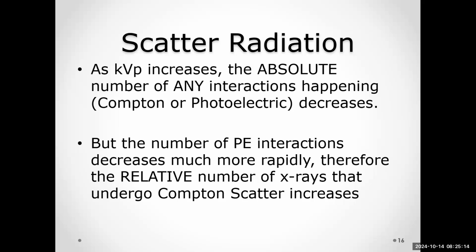What this is saying is, even though overall, when we increase kVp, the chance of anything happening goes down, relative to those two interactions, meaning photoelectric compared to scatter, scatter is going to go up.